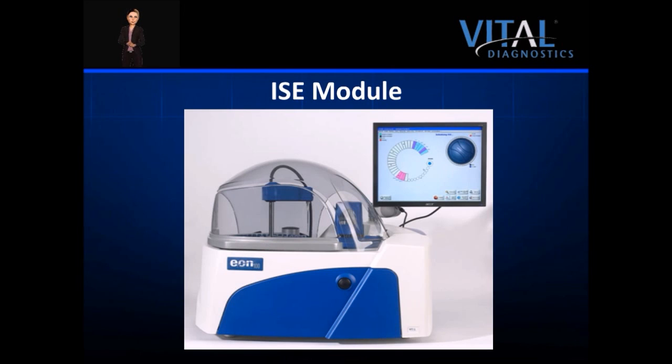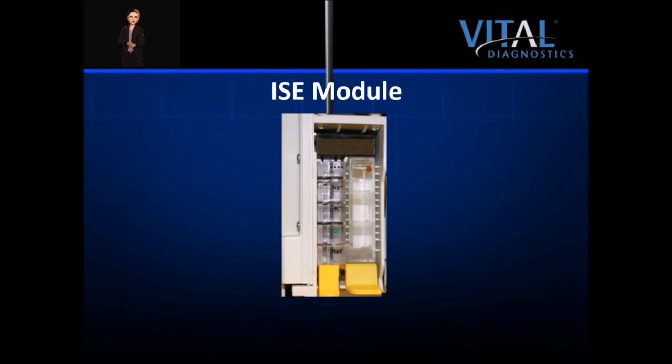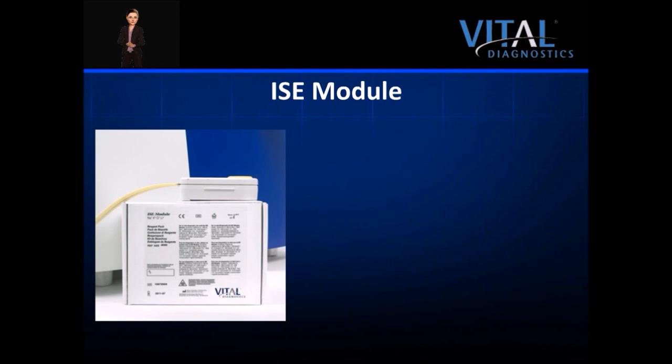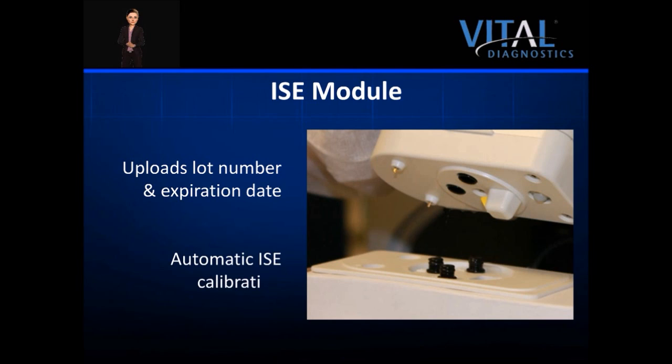The integrated ISE module is located behind the blue easy access panel door on the front of the analyzer. Sample is supplied down to the ISE stack through the port in the sample tray. ISE testing includes sodium, potassium, and chloride. The electrodes are keyed to ensure their proper placement in the stack. The system utilizes an easy-to-use ISE reagent pack containing all liquids required for electrolyte analysis, including a waste container. The pack is fitted with a Dallas chip that automatically uploads information such as lot number and expiration date to the analyzer. The system automatically performs an ISE calibration every 8 hours to ensure quality results without operator command.